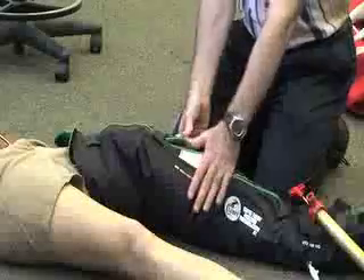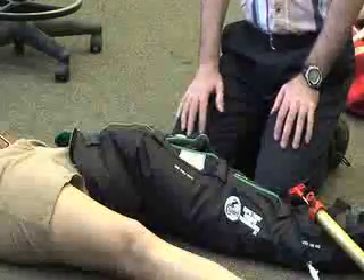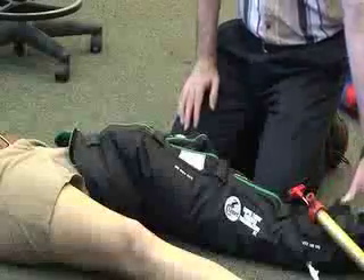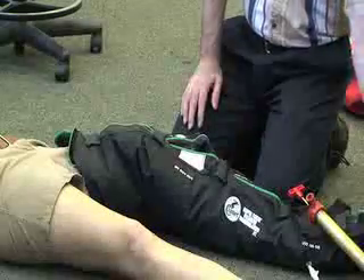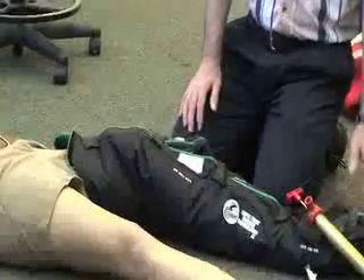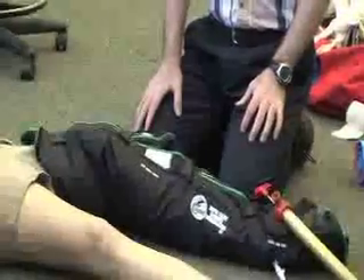And the last thing you want to make sure you do is check the pulse and circulation for the distal pulse.